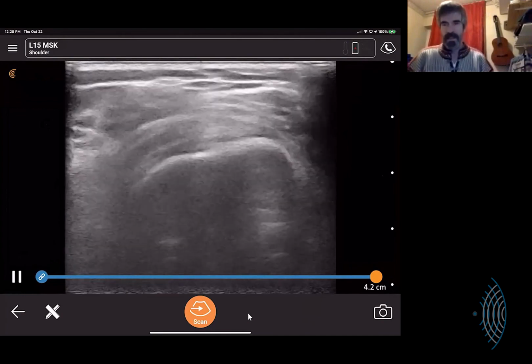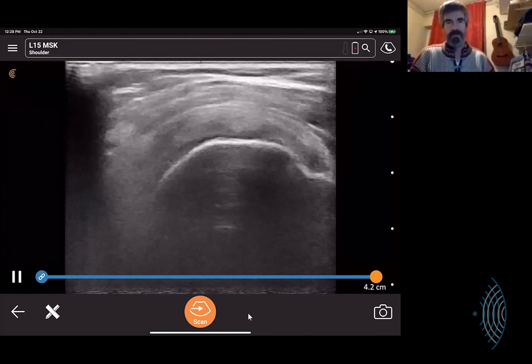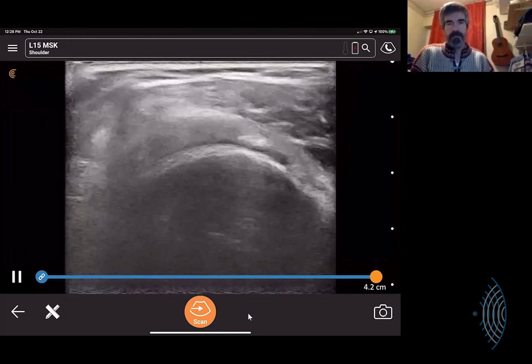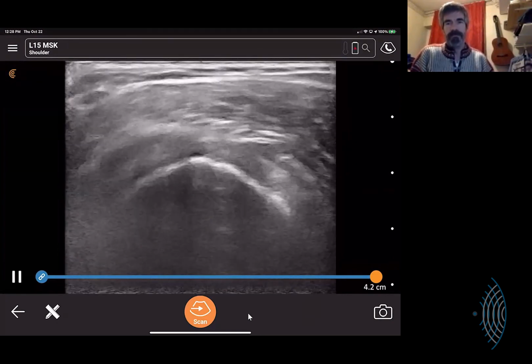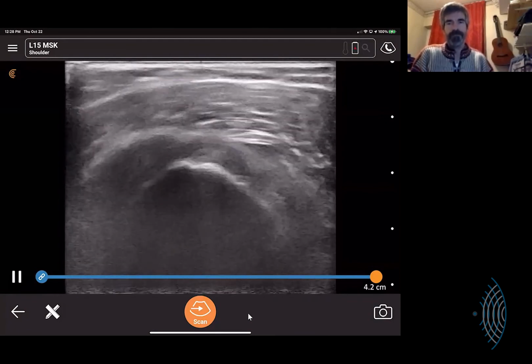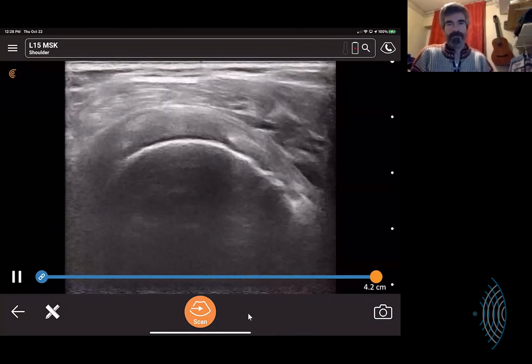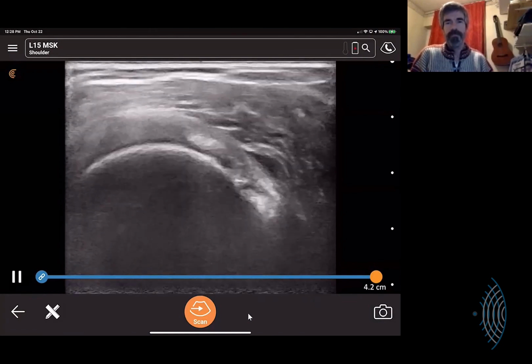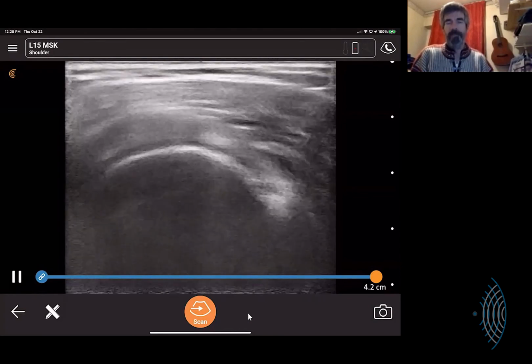This is the last one I'm going to share with you. This is what I was attempting to do for an interval view of the supraspinatus. You can see the long head blink in there periodically, and you'll ultimately be able to see the subscapularis, and I believe at the edge of the screen you'll be able to see that bursal area.